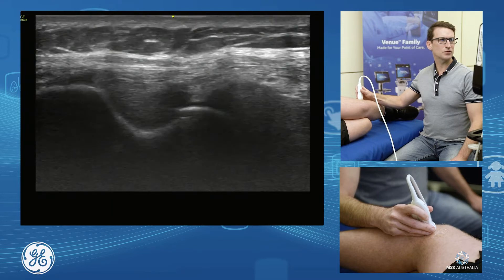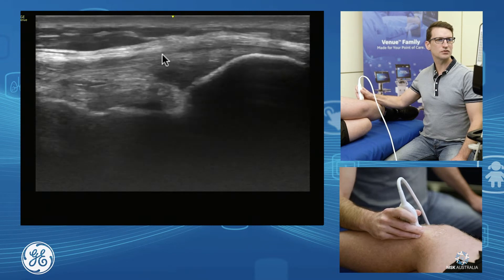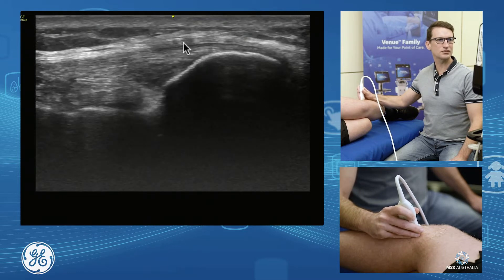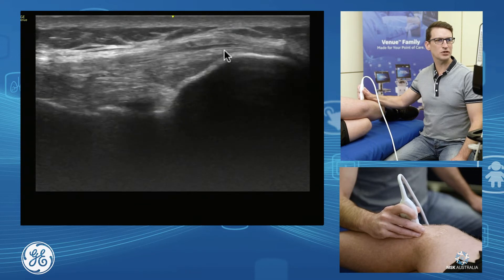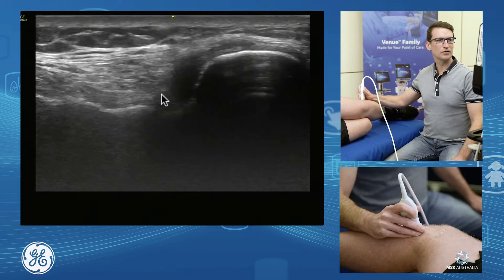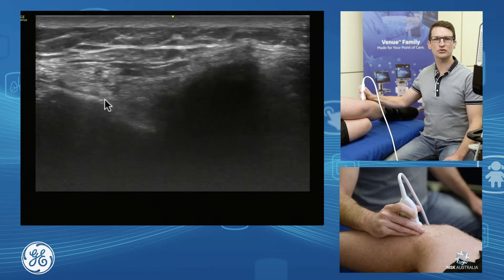We can follow the lateral collateral ligament right across to its insertion. As we come down, we see our biceps femoris tendon wrapping either side — it hugs around and has insertion onto our fibula and a little bit coming down onto our tibia. So that biceps femoris insertion tends to be majority fibula head but also a few fibers coming across onto our tibia.